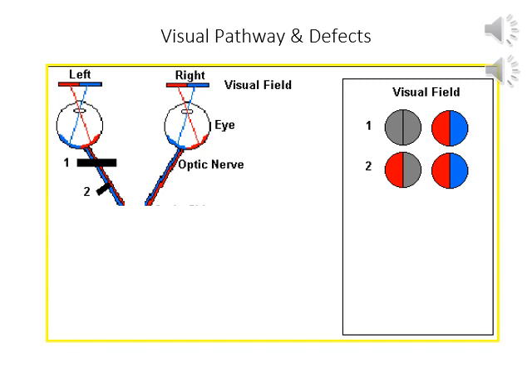And so you see on the right-hand side that the gray part, the right visual field, which activates the left retinal field, is gray because nothing can pass through on the left temporal field of the left eye. Whereas input to the left visual field of the left eye can activate the right retinal field of the left eye, and so we see the red of the left eye.